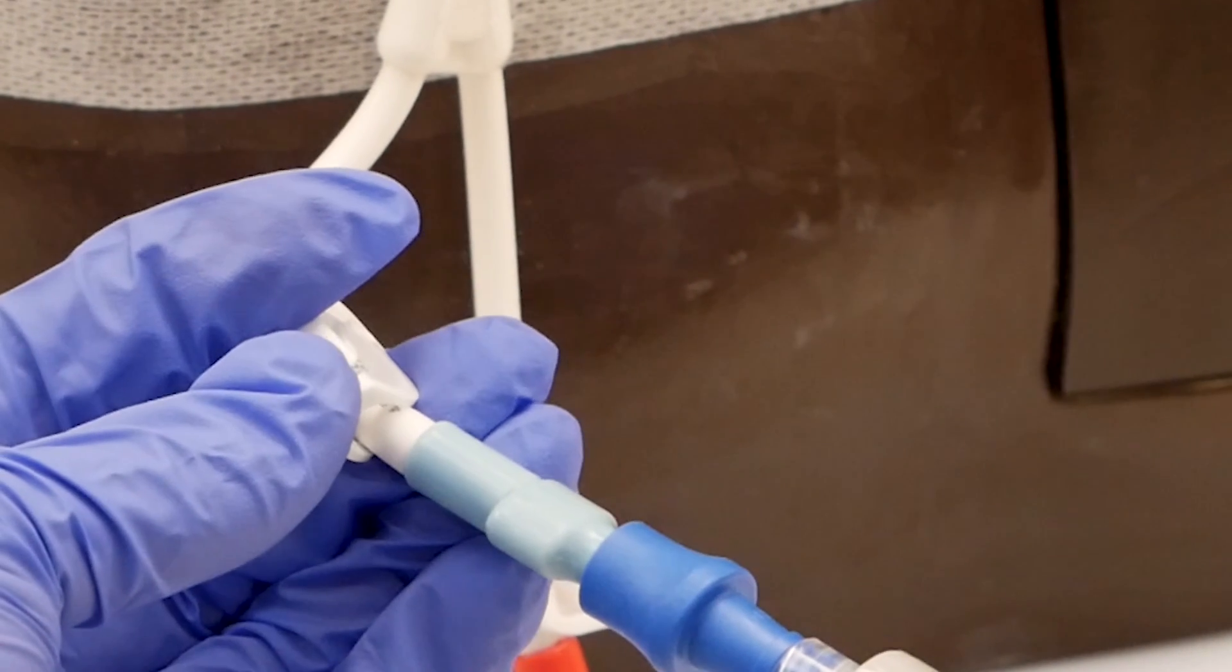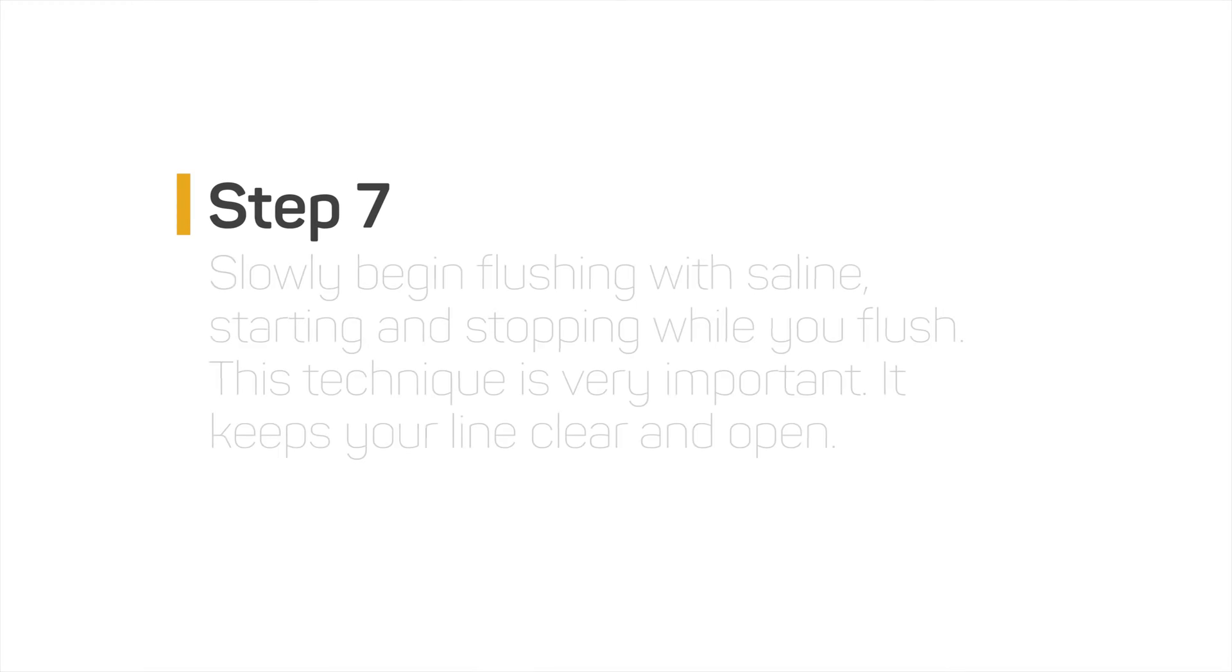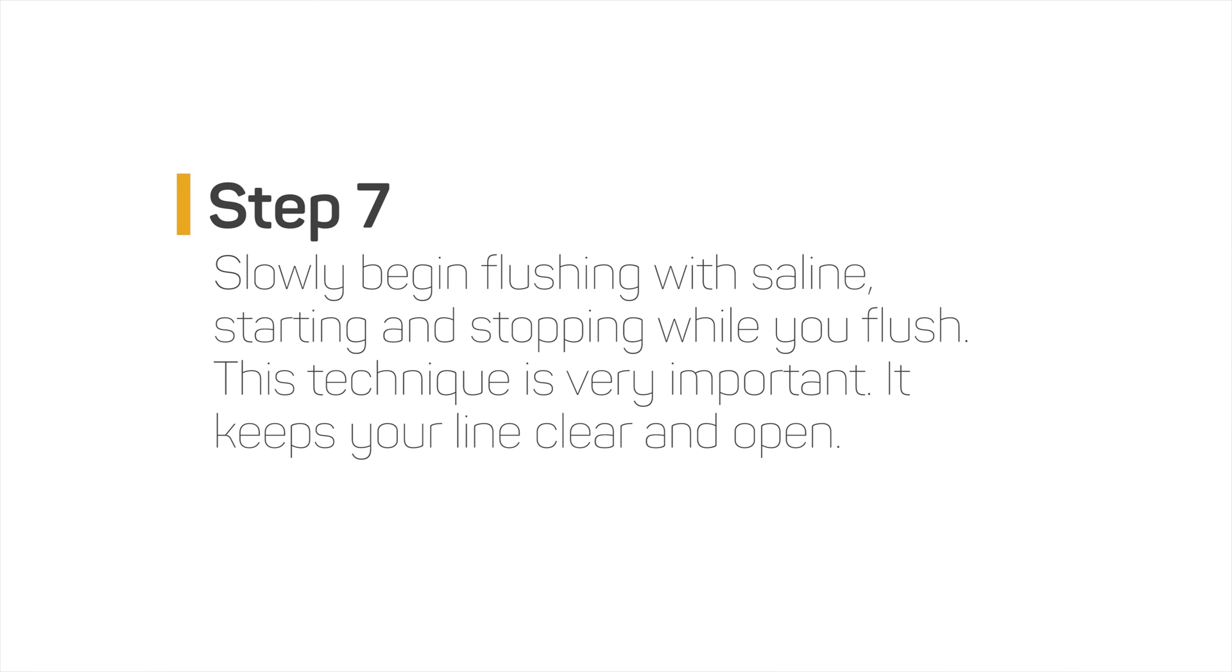Step six: unclamp the central line. Step seven: slowly begin flushing with saline starting and stopping while you flush. This technique is very important. It keeps your line clear and open.